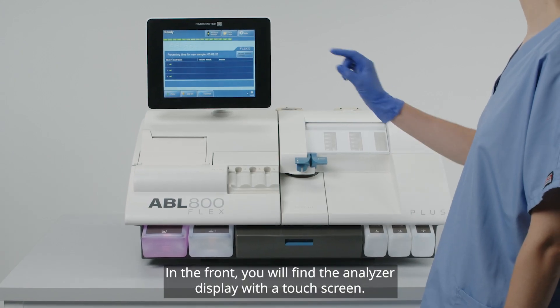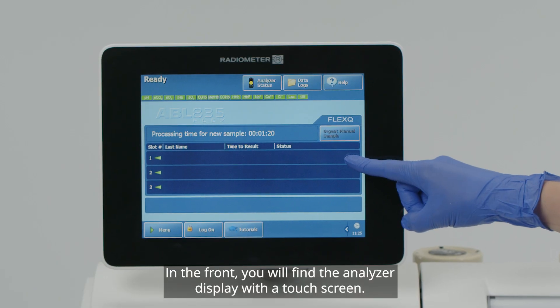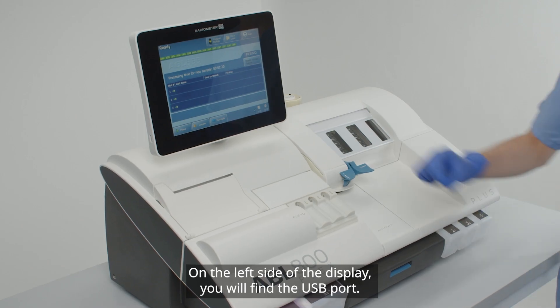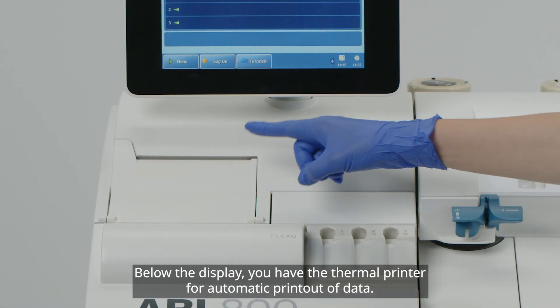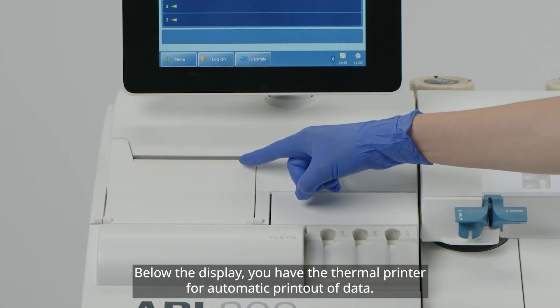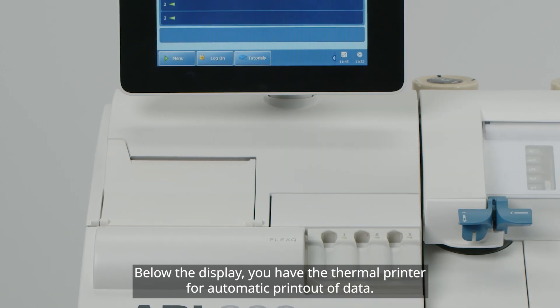In the front, you will find the analyzer display with a touchscreen. On the left side of the display, you will find the USB port. Below the display, you have the thermal printer for automatic printout of data.